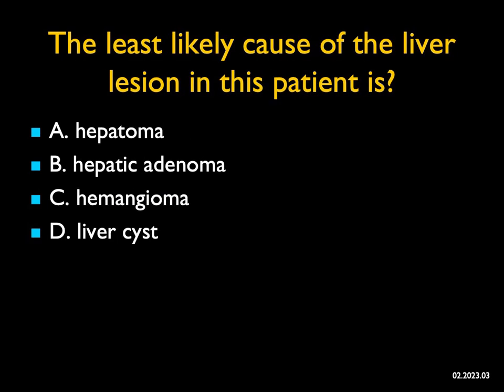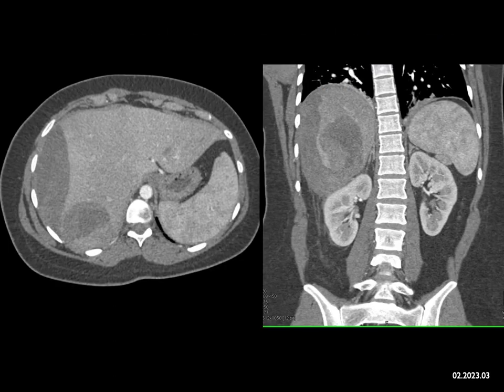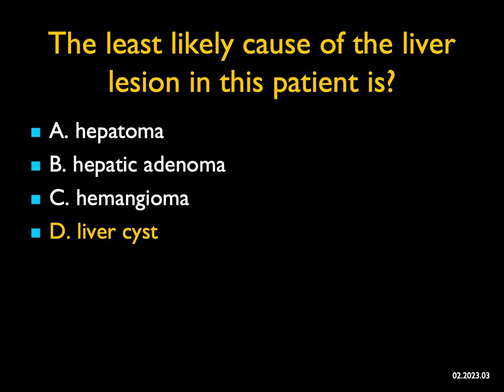The least likely cause of the liver lesion in this patient is? If you look carefully at the axials and coronals, what you see is a mass in the right lobe of the liver which bled — there's a subcapsular collection. What things bleed? I classically always think about hepatic adenoma, and right up there with that is hepatoma. We rarely see hemangiomas bleed, except if they're biopsied or with trauma, though there are reports in the literature. Liver cysts, even large cysts, never bleed. So the least likely cause would be a liver cyst.